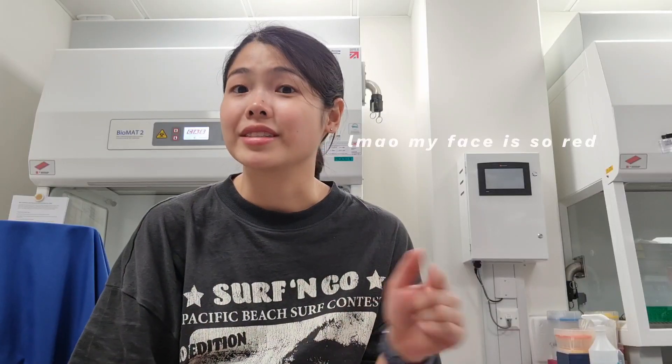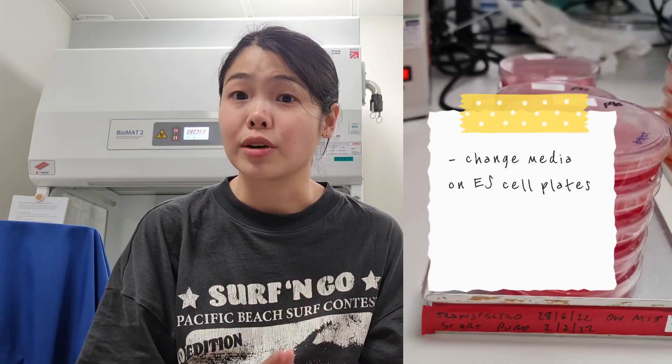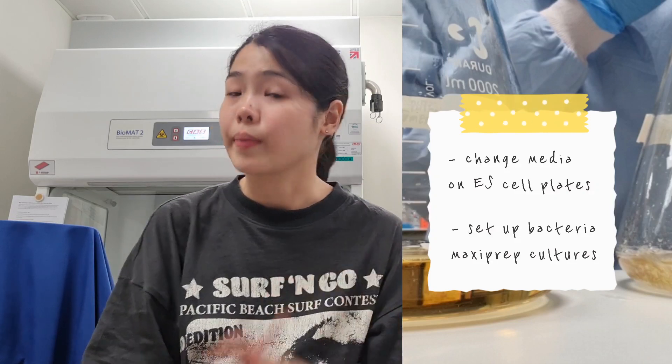So I've just arrived in the lab and I'm now in the tissue culture room. I just saw a colleague leaving as well. My plan for now is to change some media on the ES cell plates. I'll put the media to warm up and in the meantime I'm also going to set up some bacteria culture so I can do some maxi preps tomorrow. Whilst I do that the media will be warm enough and then I'll be able to change the media on a number of 10cm, 6-well, and 24-well plates.